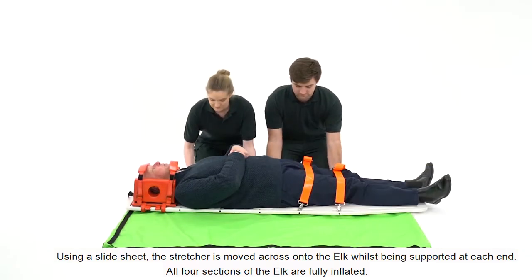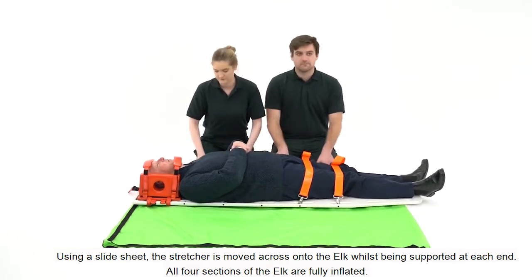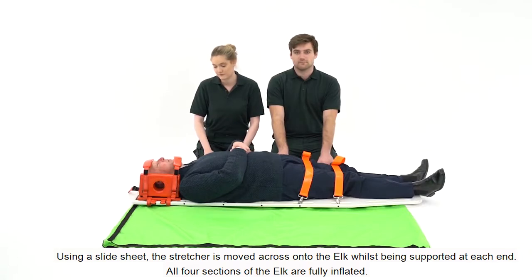Using a slide sheet, the stretcher is moved across onto the ELK. Whilst being supported at each end, all four sections of the ELK are fully inflated.